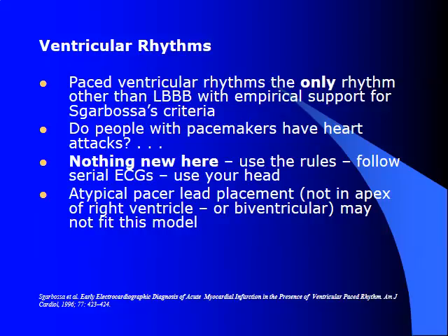We looked at them in our previous lectures when we were doing rhythm interpretation. There's not really anything new here. You're going to use Sgarbossa's criteria and follow using serial EKGs and correlate to the patient's presentation. Atypical pacer leads that aren't in the apex of the right ventricle or biventricular pacemaker leads may not fit this model, but those are pretty easy to pick out whenever you see them as well.